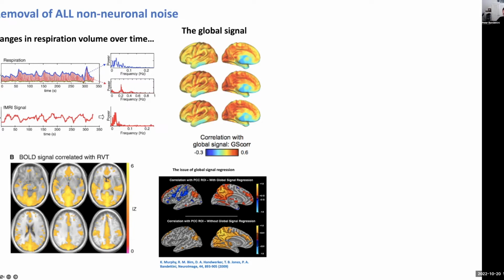typically what you find is that if you have large enough areas that contribute to the fluctuations that are real neural activity, that will dominate, that will contribute so much to the global signal that after you regress all that out, suddenly you have areas that, if you didn't do global regression, showed no correlation, and in reality they're not correlated, but suddenly they look negatively correlated because you shifted the mean down to zero.